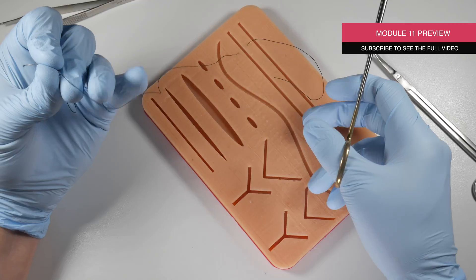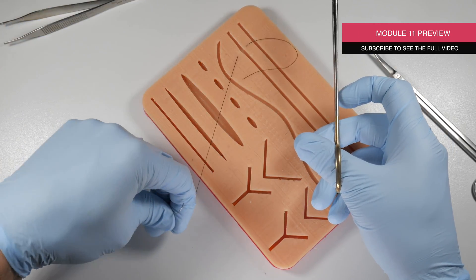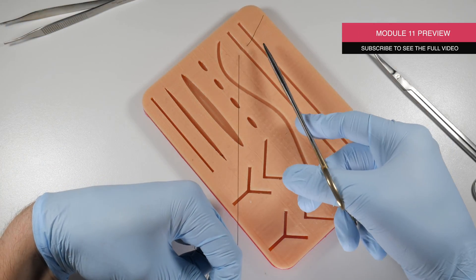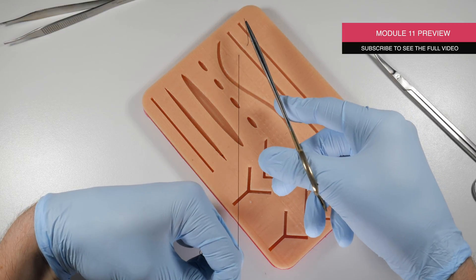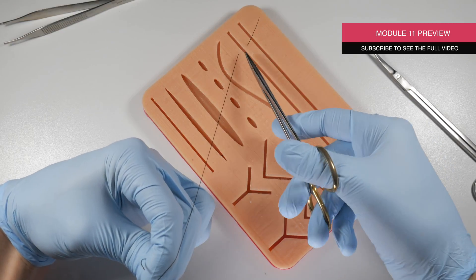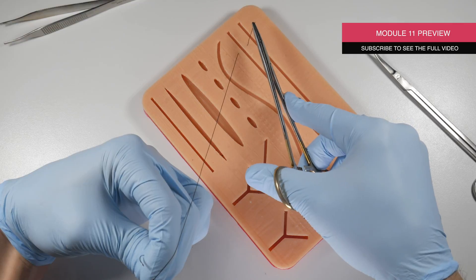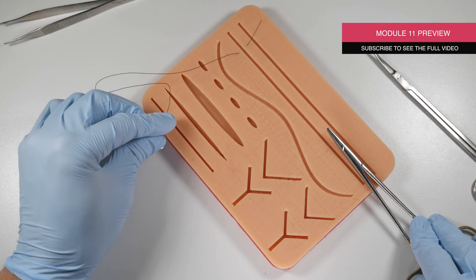It's kind of a hassle to try to manage that, so make sure that this is very short when you go to do it. Have your assistant suctioning the end of this in the surgical suction so that it's right where it needs to be when you go to grab it as you're tying your knot.